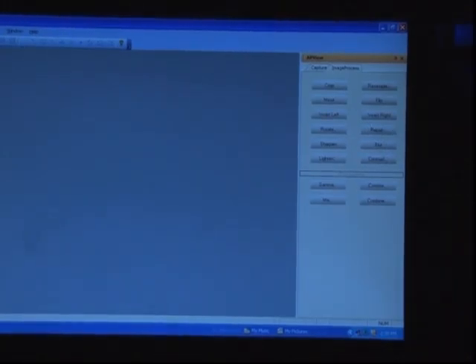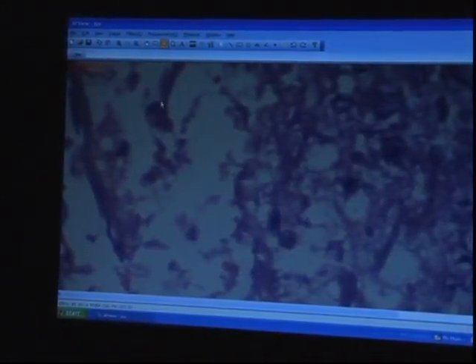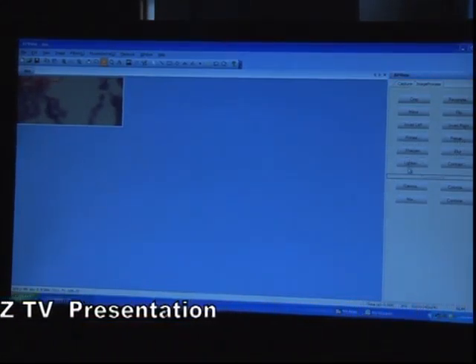To use these options, we first need to open an image from the file section. Since we haven't captured any image yet, we go back and capture an image through the capture option. Then we go to image process and open the file. For cropping, we select the area we need to crop and press Crop. We can also use mirror, invert left, invert right, flip, resample, rotate by any angle, blur, sharpen, lighten, or contrast.